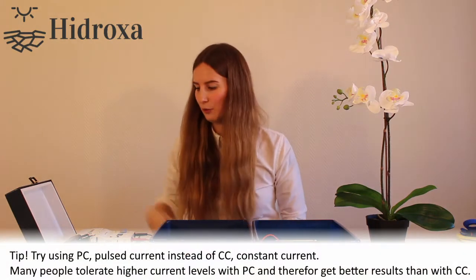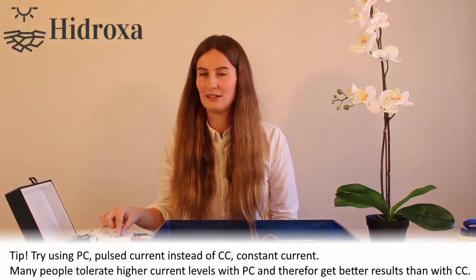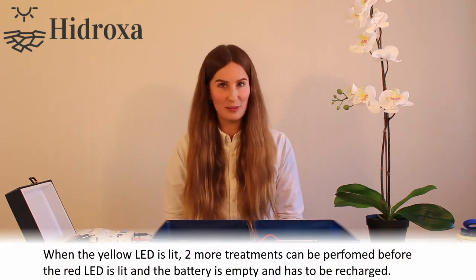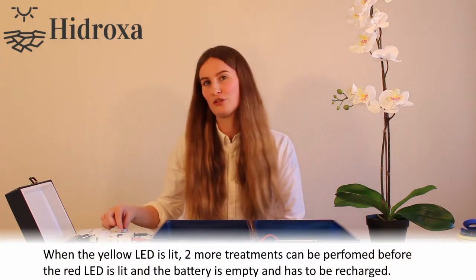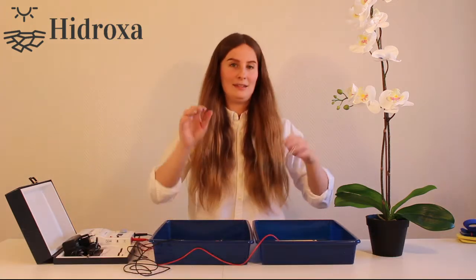Then choose if you want pulsed current or constant current — we do recommend in most cases that you use pulsed current. You are now ready to start your treatment. Turn on your device, choose your desired level of current, and place each hand in each container to start your treatment.